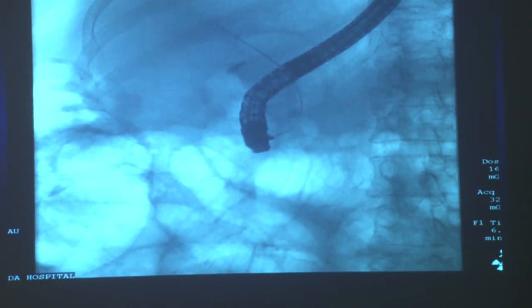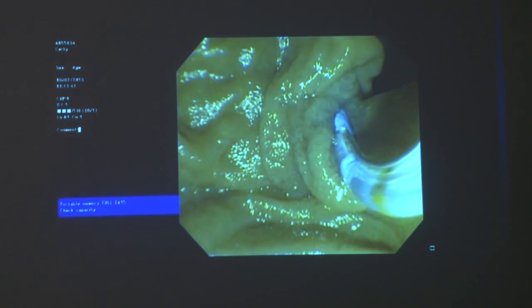You go in, hook your sphincterotome in there with the wire, and then pull it back. Sometimes you have to pull the whole wire back into the sphincterotome — because if the wire is inside and you're still in the wrong position, you're never going to get into the straight position. The wire has to come back while you are still engaged with the papilla. The sphincterotome tip is still in, but the wire has to come back completely. You bow and pull the sphincterotome towards you — that straightens it. If the wire and the sphincterotome are in the wrong place and you keep the wire in and pull the sphincterotome, it won't work because you'll go back to the same position.